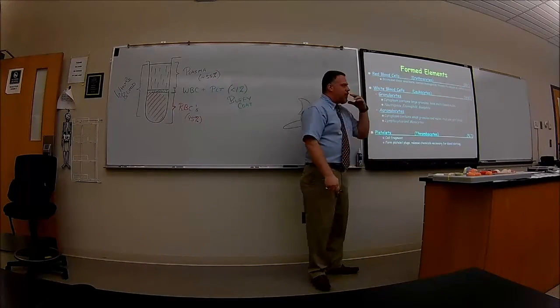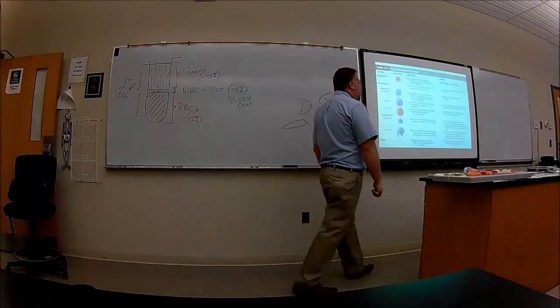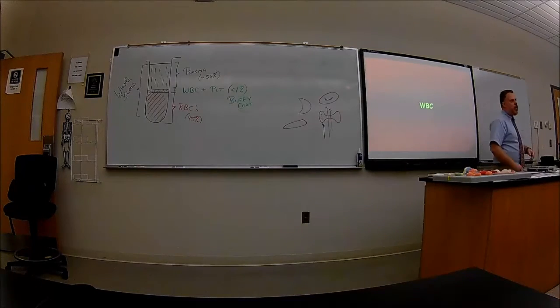Alright? So we're going to get into these in a moment. And then the platelets, like I said, is a cell fragment of a gigantic cell. Okay? And this is what they look like. Alright, so let's do the white blood cells. We'll run this off for about 15 minutes or so, and I'll show you how to do this. Alright? Pretty easy to manage. It'll get you ready for lecture stuff also.